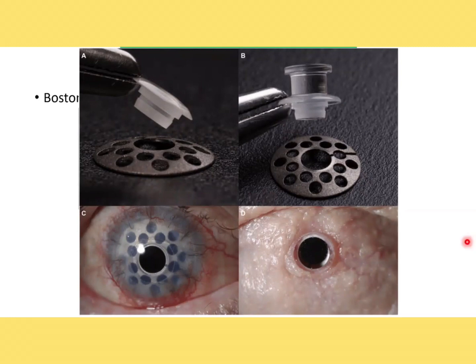So the indications of this Type 1 Boston keratoprosthesis: this Type 1 K-Pro is indicated for individuals with corneal blindness or severe corneal damage who have failed traditional corneal transplantation surgery, that is penetrating keratoplasty, or are not suitable candidates for transplantation due to ocular surface disease or chemical injury or autoimmune disorder or multiple graft failure. So those patients are suitable for this Type 1 Boston keratoprosthesis.